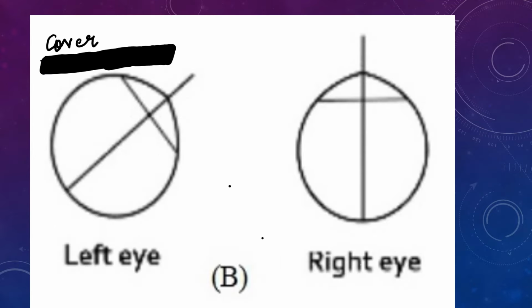However, now if you place a cover on the left eye, what are you doing? You're forcing the right eye, which was the paretic eye, to take fixation. Now the right eye was already a weak eye that had squint, it was inwardly deviated. Now as you put a cover in front of the left eye, the right eye has to take up fixation to bring the object onto the fovea. That means the right eye lateral rectus has to do so much work to pull it outwards so that it becomes straight, right? So now the fixating eye is which eye? It is the right eye.